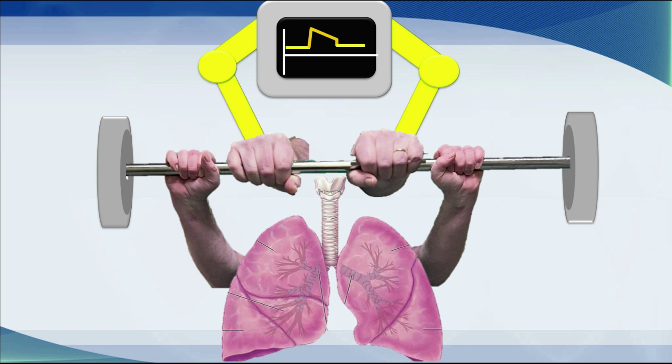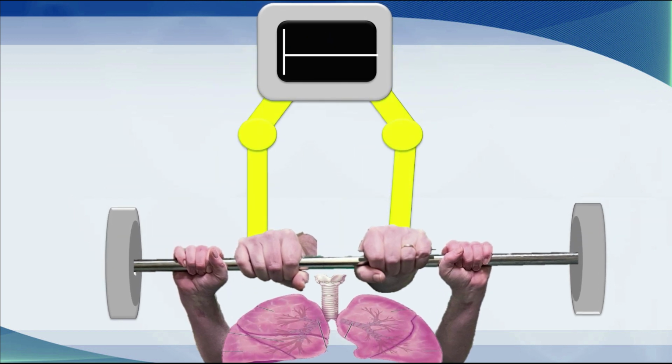As clinicians, we try to evaluate or determine how much support the ventilator gives the patient, usually using pressure support, how much lifting the patient has to do and how much lifting the ventilator has to do. This is very, very difficult to actually figure out because once the breath starts on pressure support, the same amount of pressure is delivered. So in this system, I'm going to show you different modes of ventilation and how they support the patient. And we're going to start off with airway resistance.